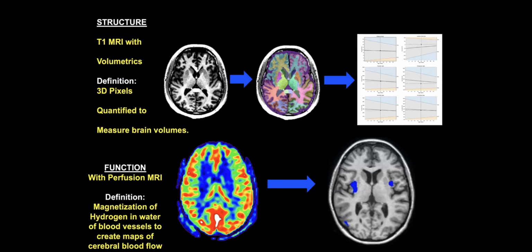Functional scans with perfusion MRI or arterial spin-labeled MRI give us the ability to look at the actual blood flow in the vessels, especially out in the gray matter and the cortex where the neurons are housed. And with that, we can create blood flow maps of the brain. This color map you're seeing, with the red and yellow colors and some of the green colors, shows higher blood flow in the brain.